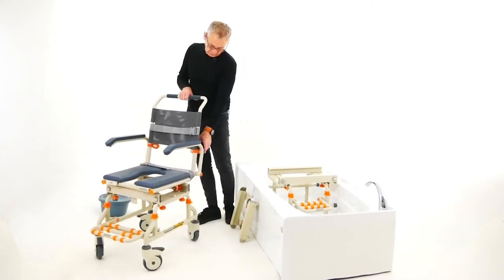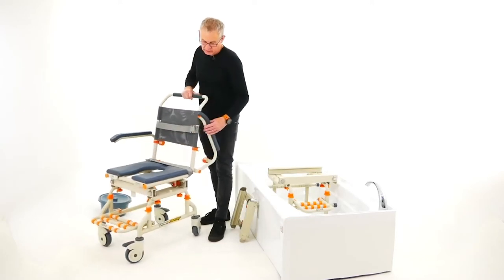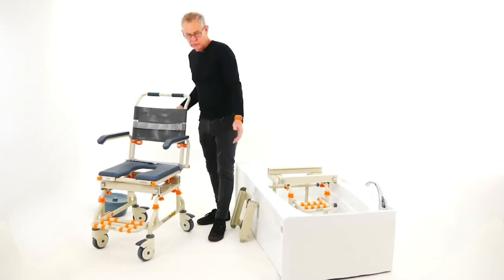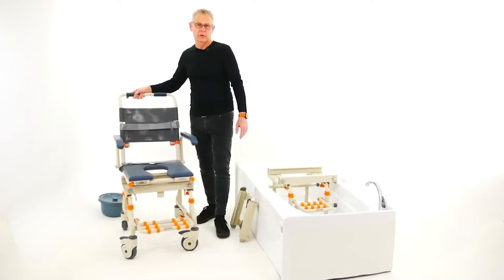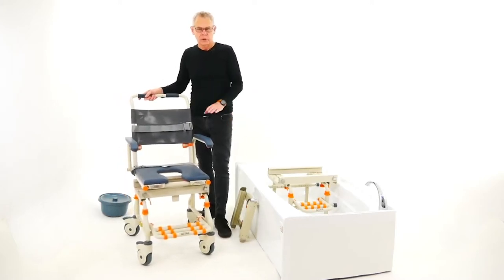For side transfers, the arms lock, unlock, and fold back. You can do a side transfer from bed, then roll to the bathroom, over the toilet for toileting, and then straight to the bathroom to shower over the bath. So there are a lot fewer transfers — a lot safer for the user and less work for the caregiver.